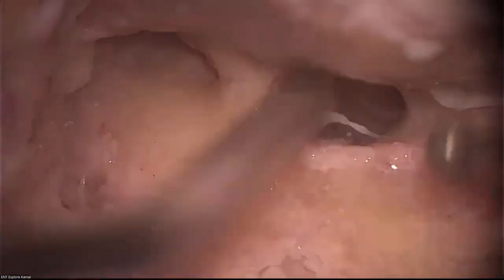And see, this is anterior thinning of the facial ridge. Can you see the tendon? Yes. You can see the pyramidal process also, the pyramidal process and the tendon. And see this thick bone anterior to the facial nerve. This is anterior thinning of the facial ridge. See how much space we have gained now.